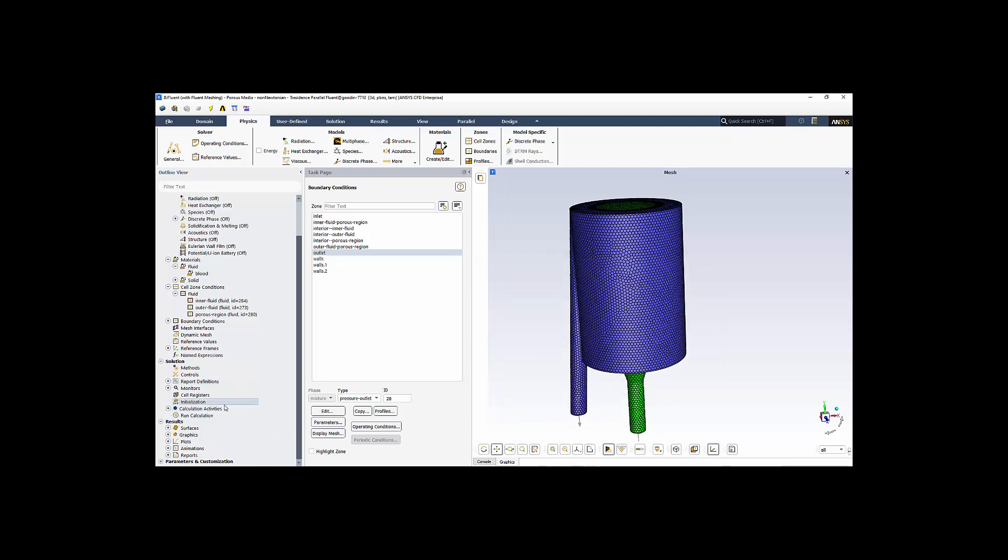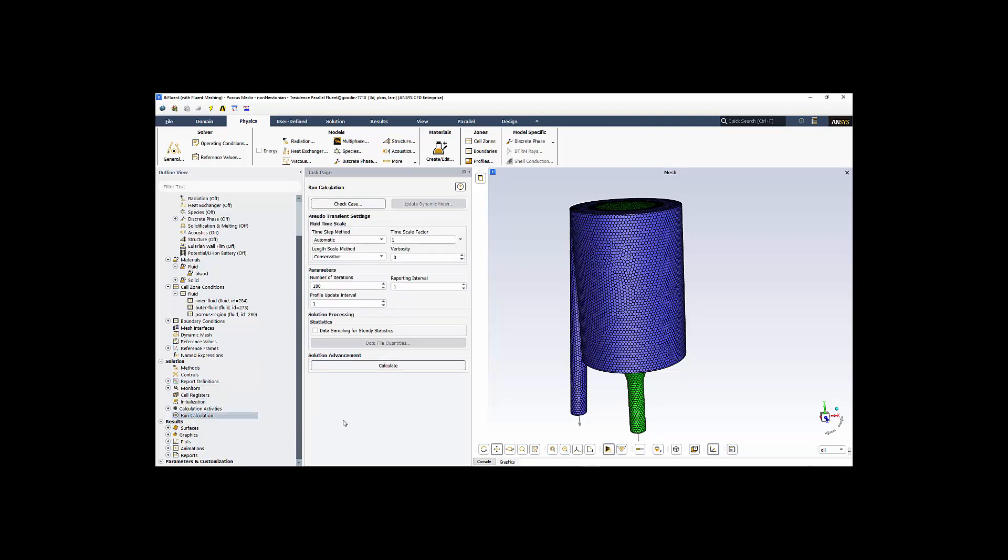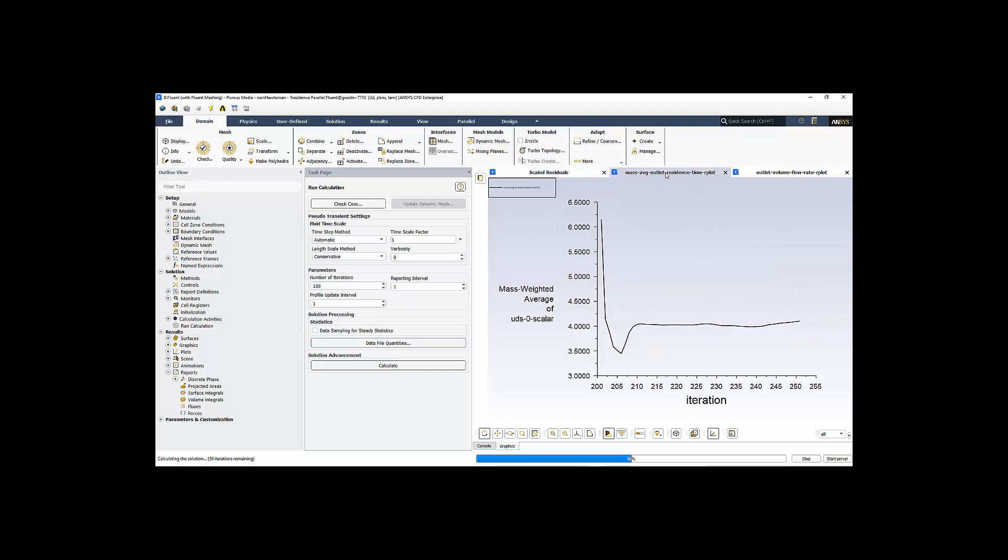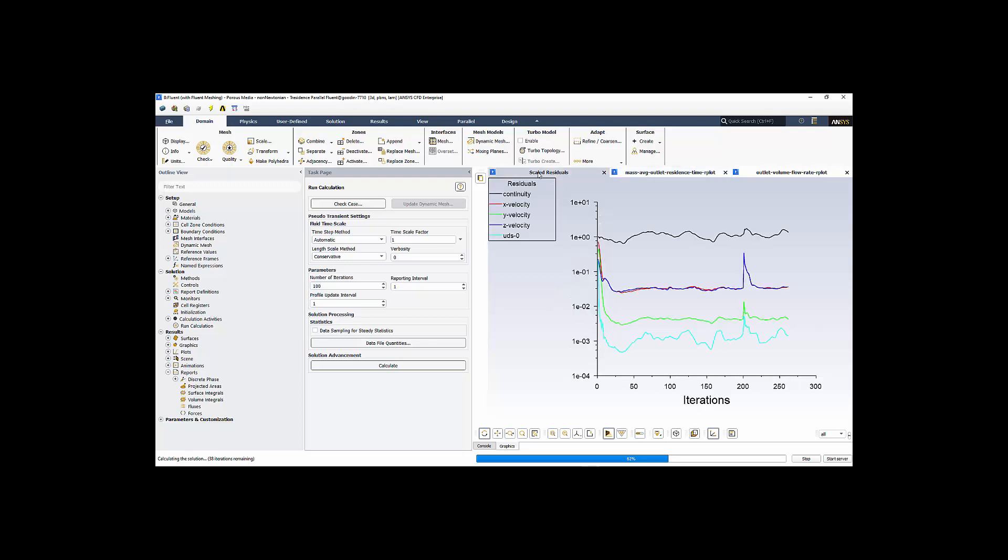Then we initialize the solution. After initializing, we run the calculation and we're off to the races. For this solution, we're running along. This is our residuals versus iteration numbers. This is a case where I restarted the solution from an earlier version. And we're running along. I'm also looking at my mass average outlet residence time, which is really stabilizing out around four seconds. That seems appropriate. It's about where you would expect based on the volume and the volumetric flow rate. And so we're running along and converging.